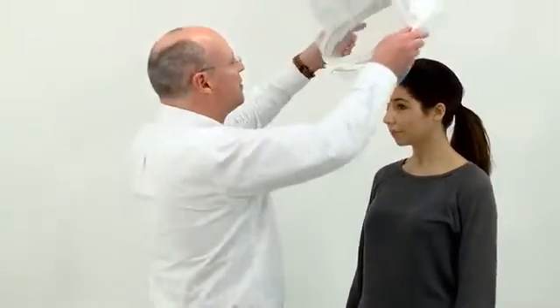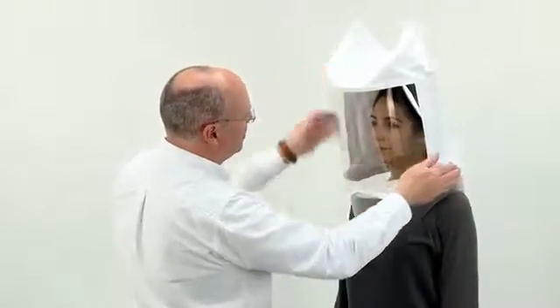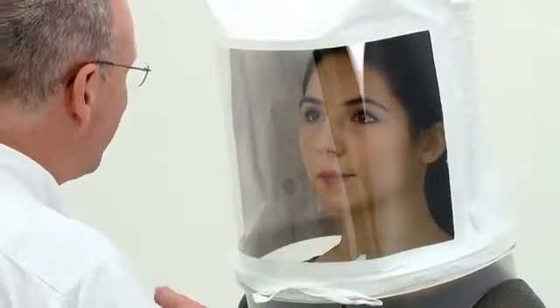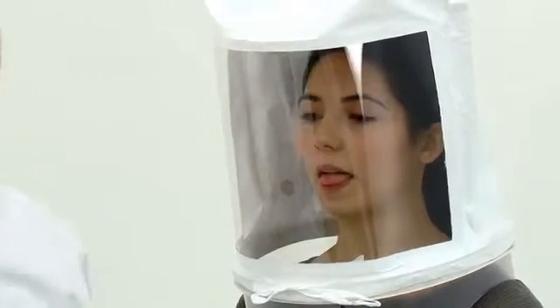Confirm that the test subject has had nothing to eat or drink except water and has not chewed gum during 15 minutes before the test. Fit the hood without a respirator fitted and arrange the hood so that there is a gap of approximately 15 centimetres between the front of the hood and the subject's face. Ask the subject to breathe through their mouth with their tongue slightly out and to indicate when they taste the solution.